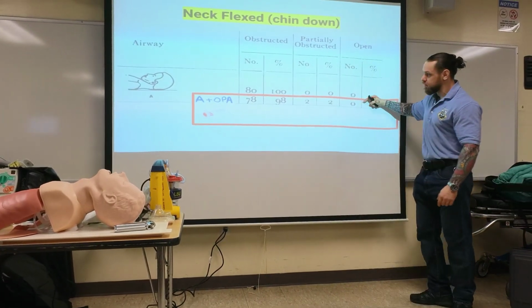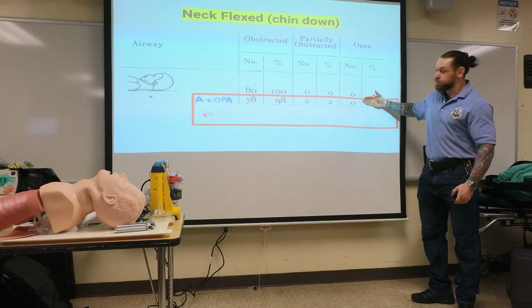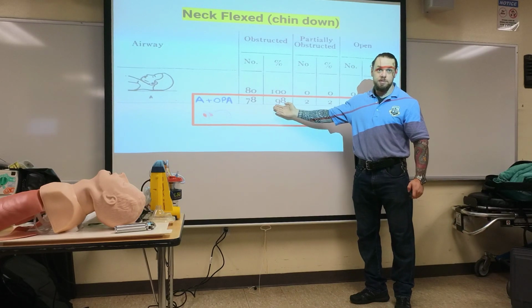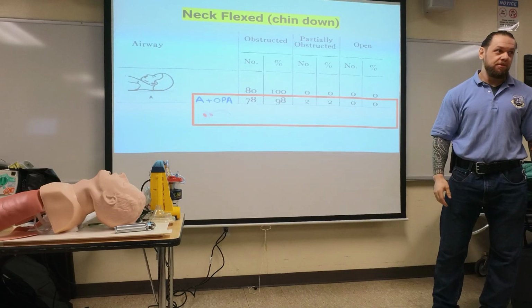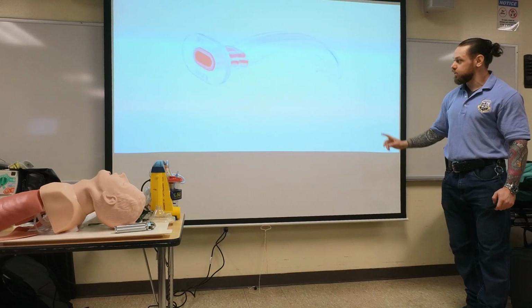This is airway open. So those who believe your OPA opens the airway, how many of them had an open airway? Zero. How many had obstructed? Pretty much all of them. So does your OPA open the airway? You tell me. It doesn't. So your OPA doesn't open the airway. So what actually opens the airway? It's not the OPA.